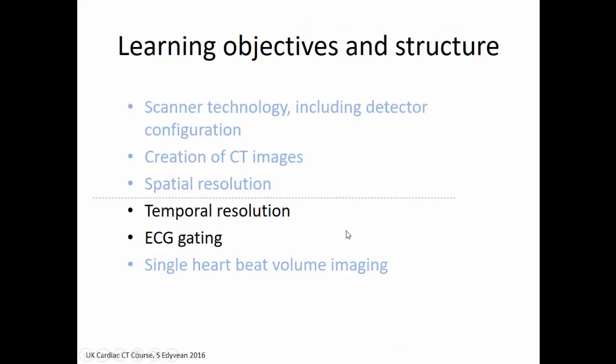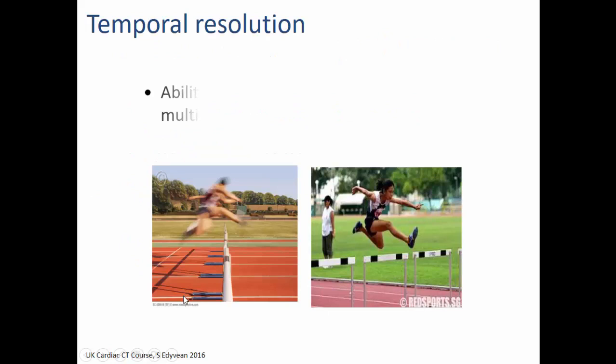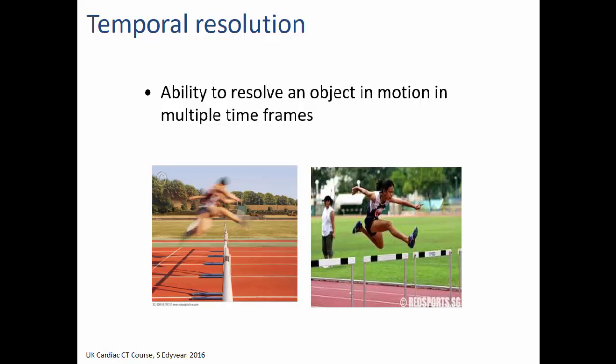So I'm running a little bit behind time, but let's move on to the specifics of temporal resolution, ECG gating, and single heartbeat volume imaging. The whole thing about cardiac imaging is you want to scan the heart very, very quickly to freeze it in motion.